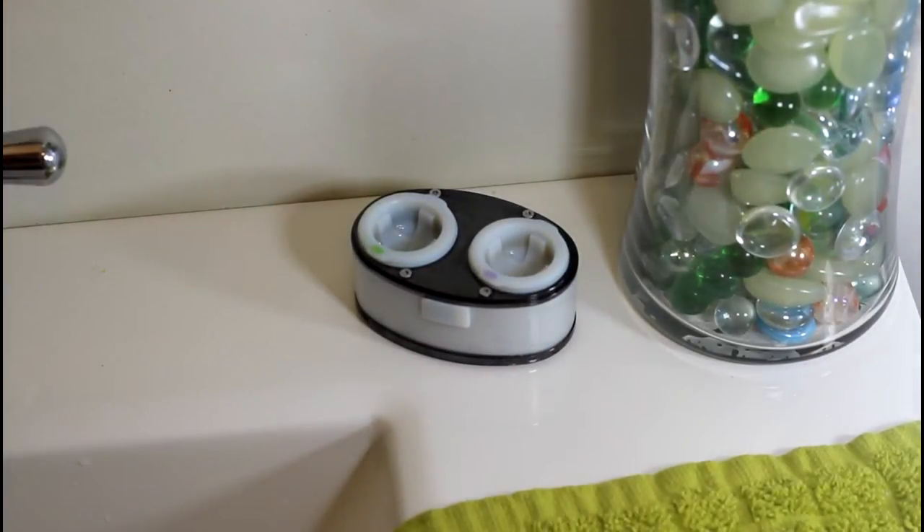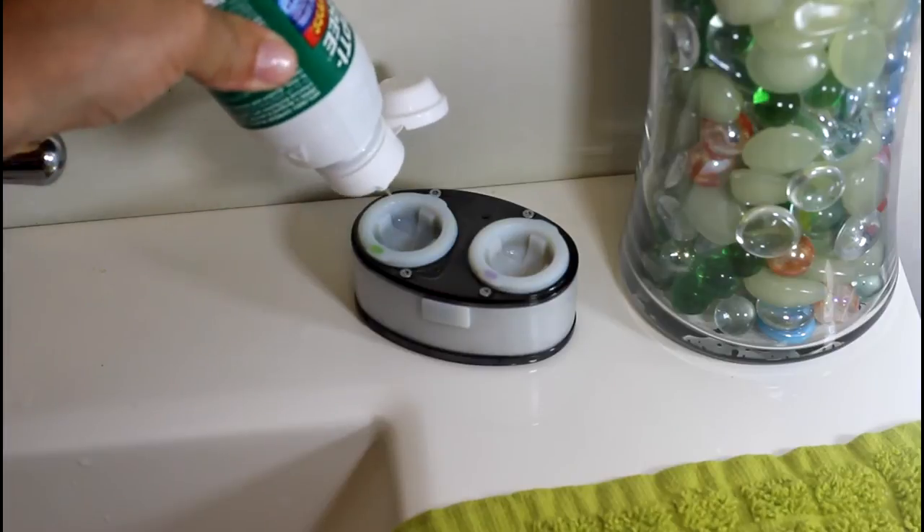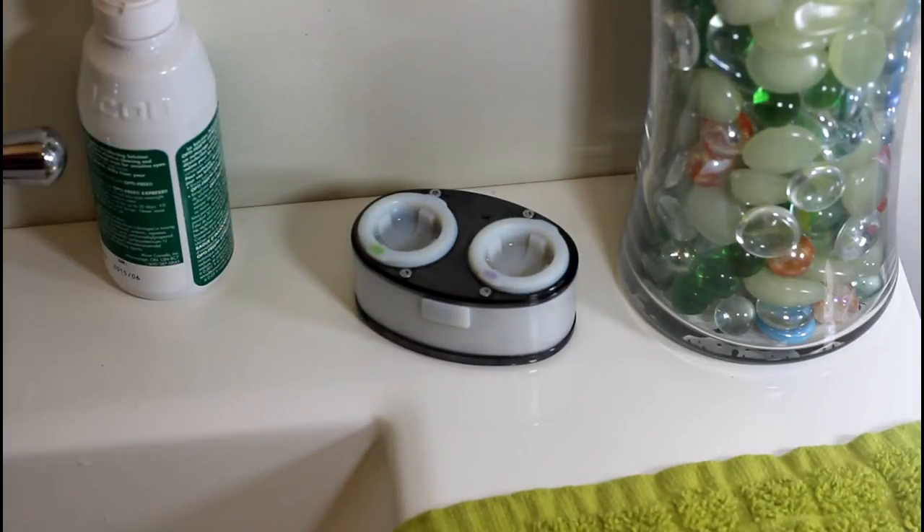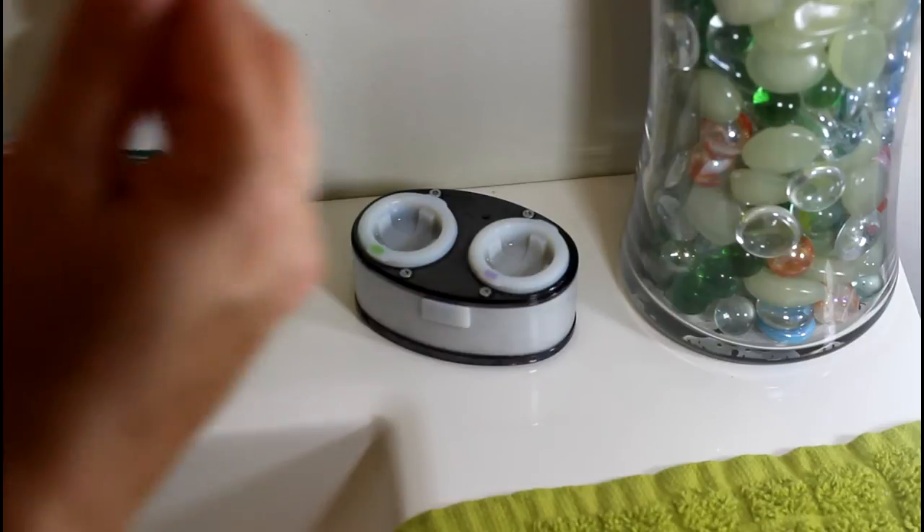Simply fill the lens baskets with your preferred contact lens solution, place your lenses in, and turn it on.